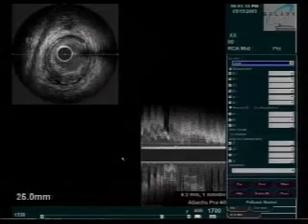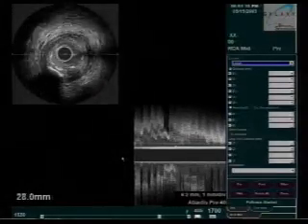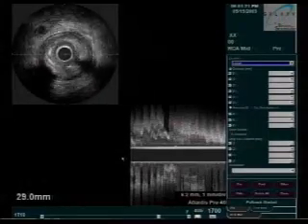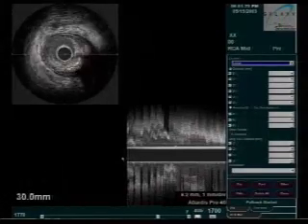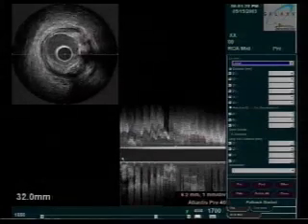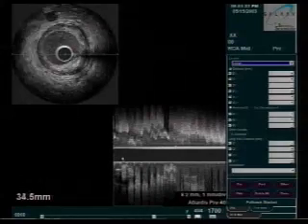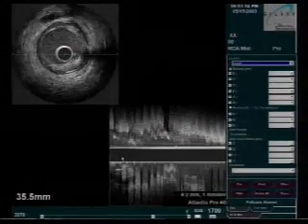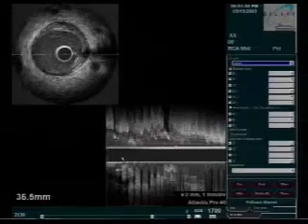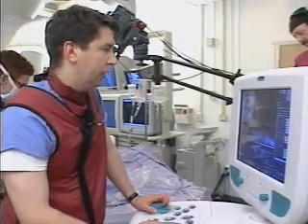If you step on the floor just for a minute. Now there's the blockage right there. Yeah. See how it's getting very narrow? Very narrow right there. It's almost completely around the camera there, Mike. Absolutely. Exactly. We'll make some very detailed analysis and measurements in a moment. But as Tim said just a moment ago, you could see the artery almost shrink down around it. It was barely bigger than the 1 millimeter ultrasound camera in the artery.